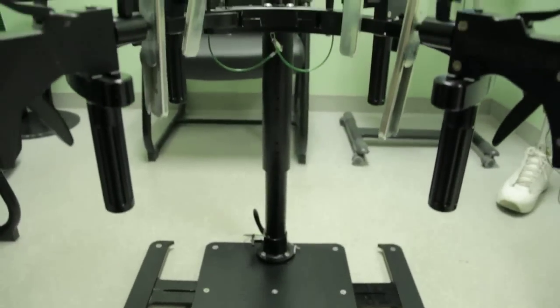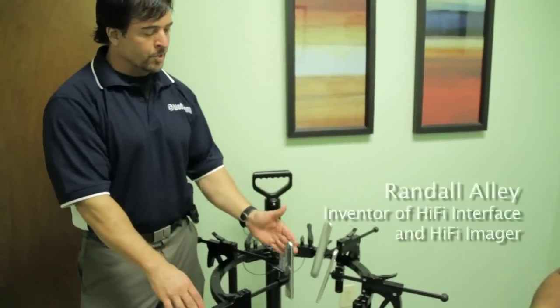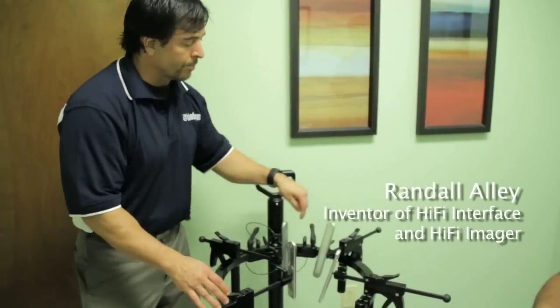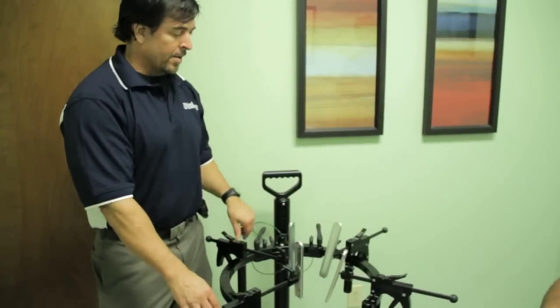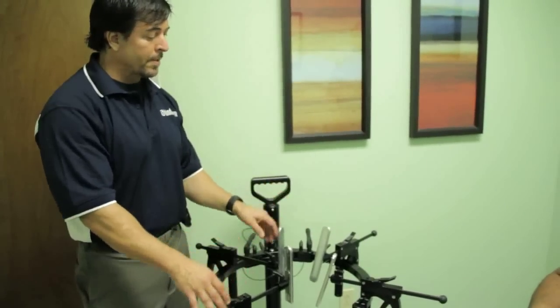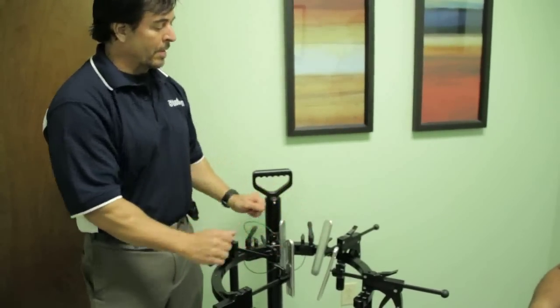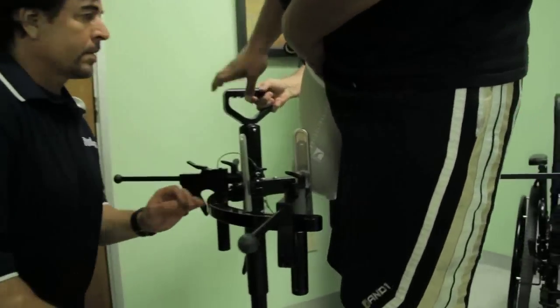This is a high fidelity imager and this allows us to adjust the amount of pressure. We can measure the pressure with sensors and we allow the tissue to come through the windows — the spaces in between these paddles. We can either scan or cast the limb utilizing this device. And then once we have everything in place, you can see this is the shape of an actual limb that was measured. From there we can go ahead and create the actual interface.